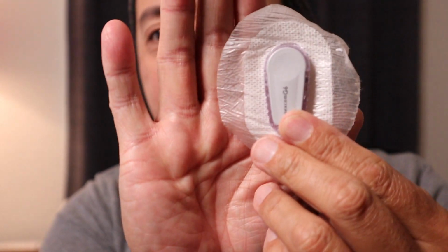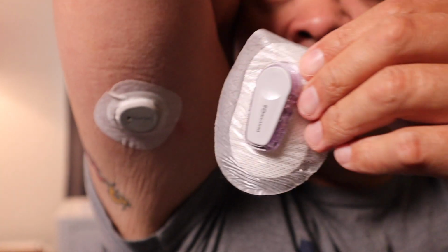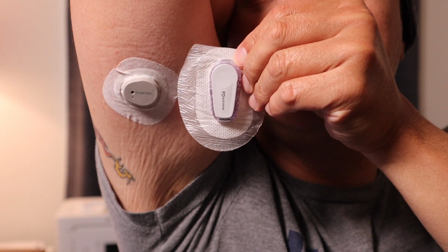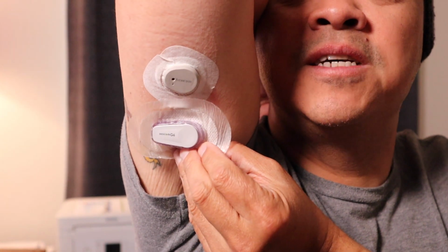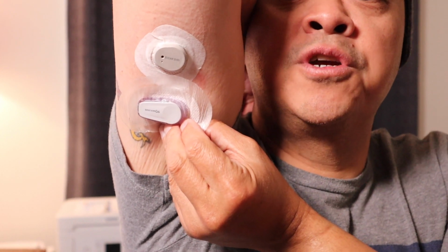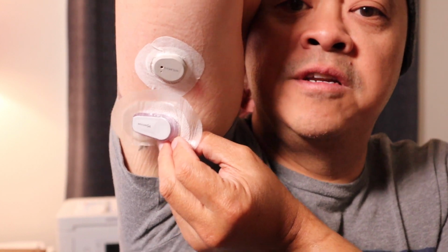Just to remind everyone of what the difference is in size. So that's the DEXCOM G6 sensor and transmitter combination compared to the DEXCOM G7 that I just installed. So if you're curious, that's the size difference. It's not significant. The new G7 is a little more circular, and again, everything is included in there. It's a one unit system, the transmitter and the sensor are in one, so I don't have to pop anything in.